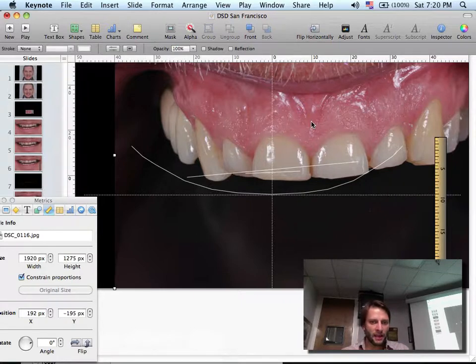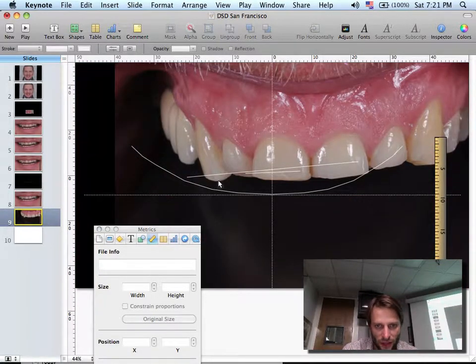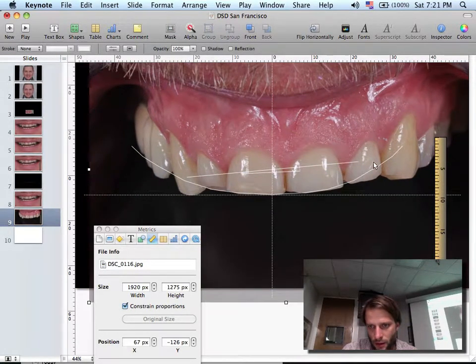Forget all the other lines and let's place one cuspid tip on one tip of the line and one cuspid tip on the other tip of the line. The same way I did with this picture. So I have to remember what part of the cuspid here I'm touching and what part of the cuspid here I'm touching. It's the inner part of the cuspid and the inner part of this cuspid. So I want to do the same over here. It's not here, it's here, and it's here and not here. I could have done here, doesn't matter, but you have to do the same on both pictures.